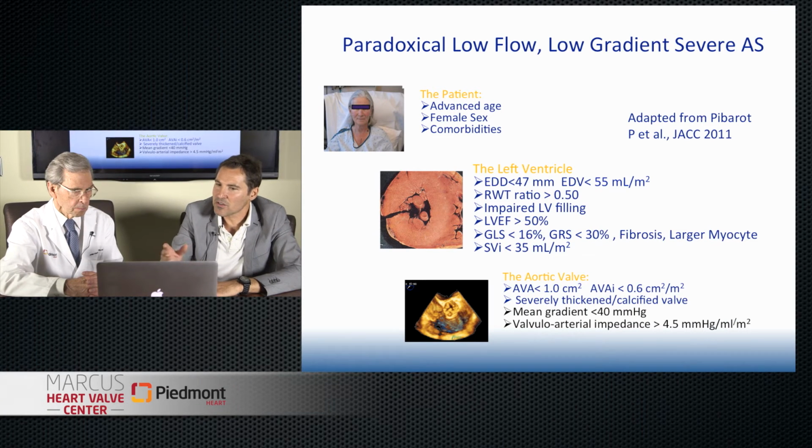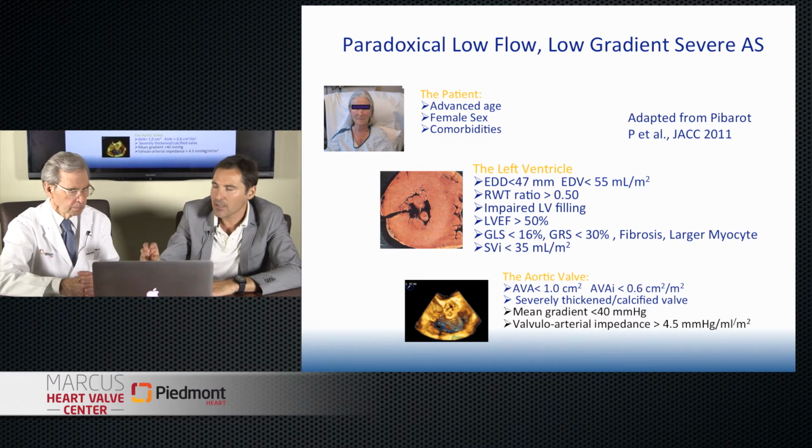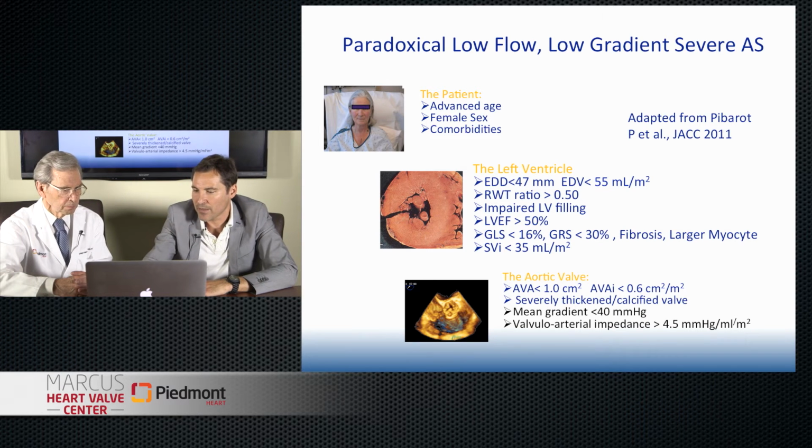That's great. Beautiful slide. So this is just the definition of the paradoxical low flow. So you have always to take the picture of the patients, of the left ventricle, the aortic valve. And if you have everything, this fits clearly with paradoxical low flow.